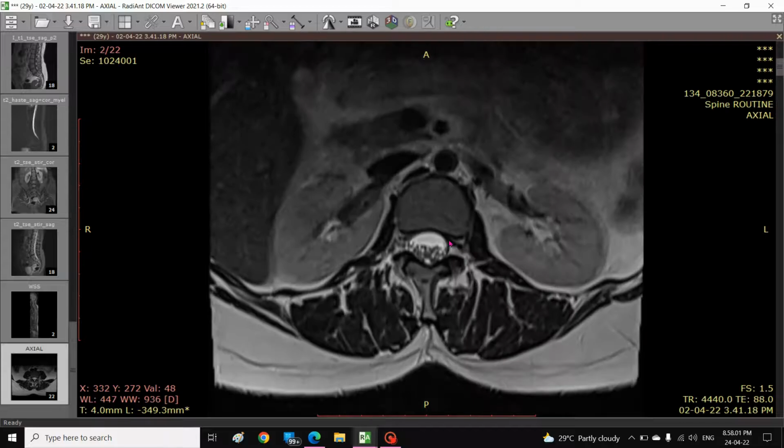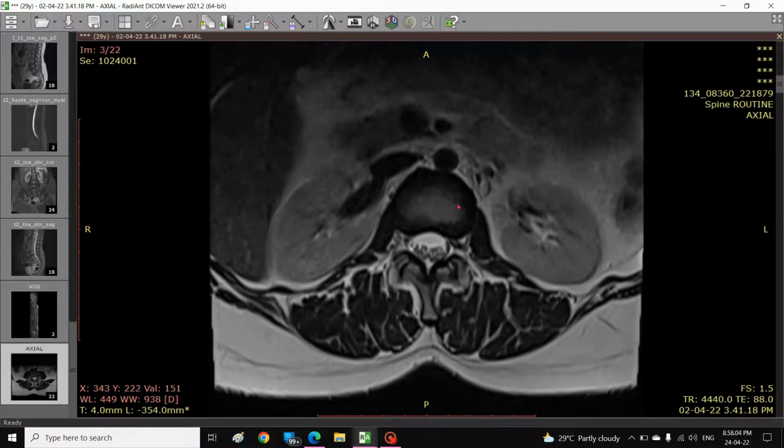And what you further see down is the disc. The slice is done at the disc level cut. So you are seeing the nucleus pulposus internally and the outer annulus fibrosus. And usually the disc in the lumbar spine in the posterior aspect, it should maintain the concavity posteriorly. That gives adequate room for the nerves and the spinal cord to suspend within the spinal canal.